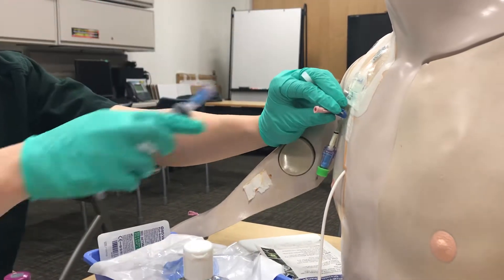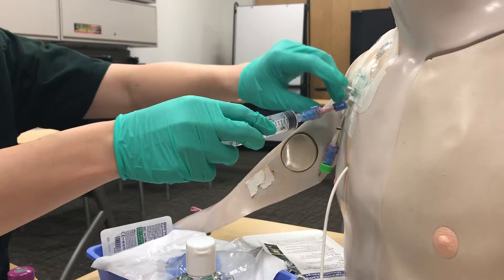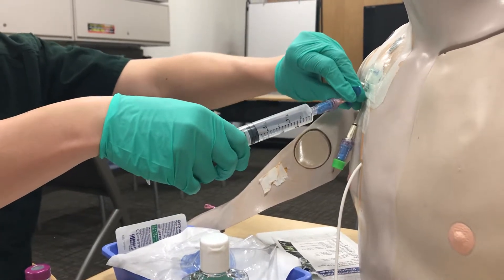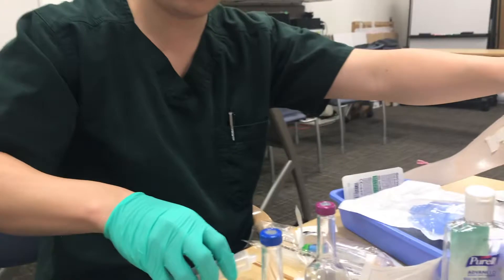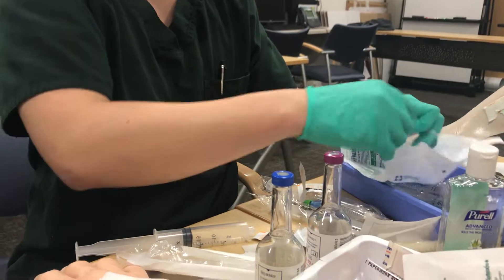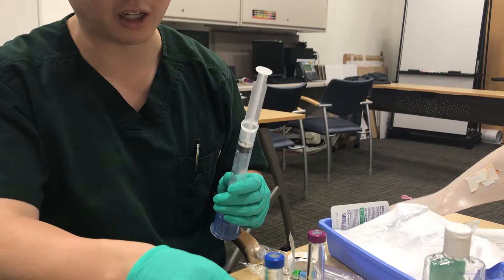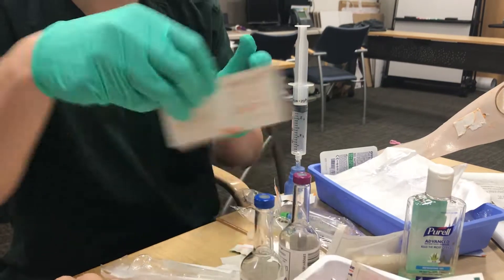Undo your cap, attach it to the hub, undo the clamp, draw out your 20 cc's, clamp it back, take off the syringe, and set it aside. Grab your transfer device, put the syringe with 20 cc's of blood onto it. Clean off your bottles — or use new ones — scrubbing each cap for 10 seconds before use.